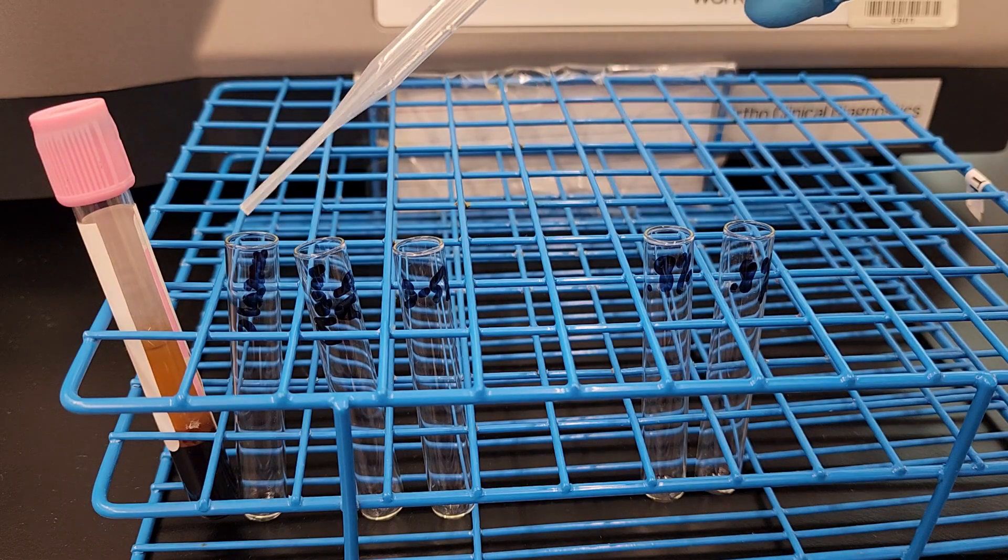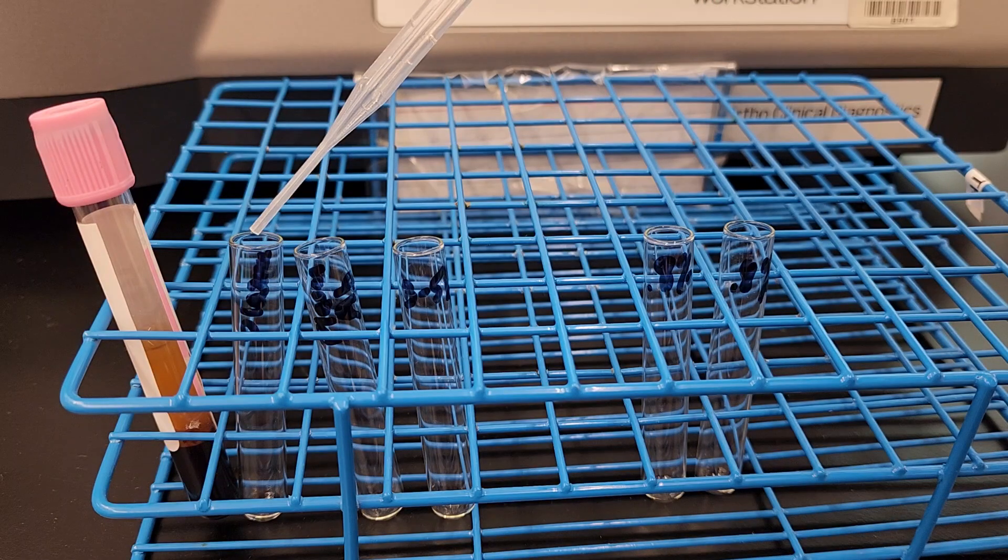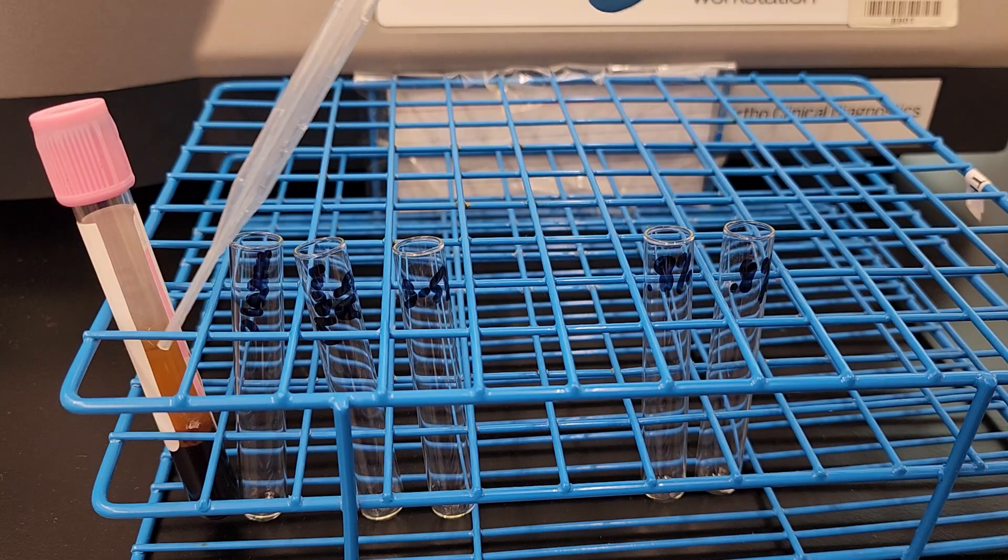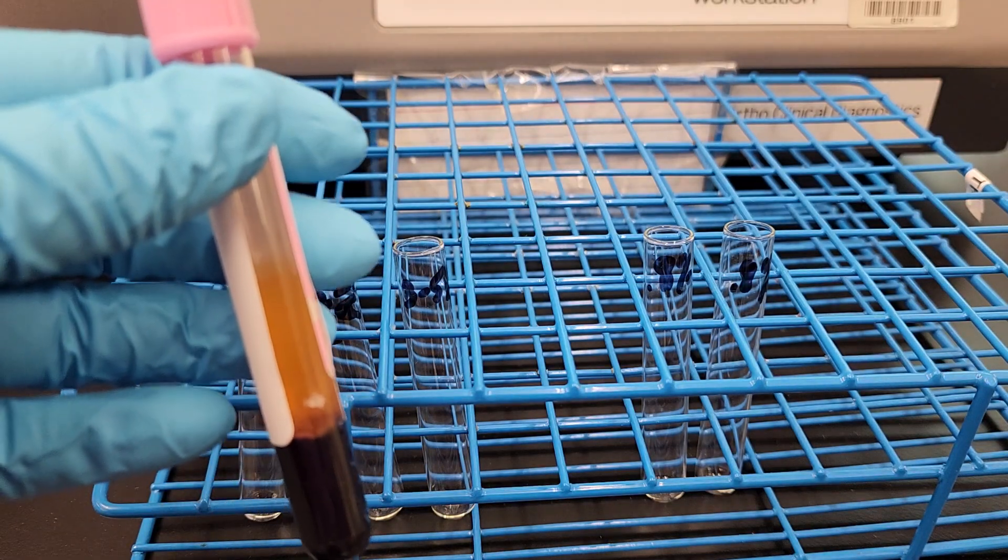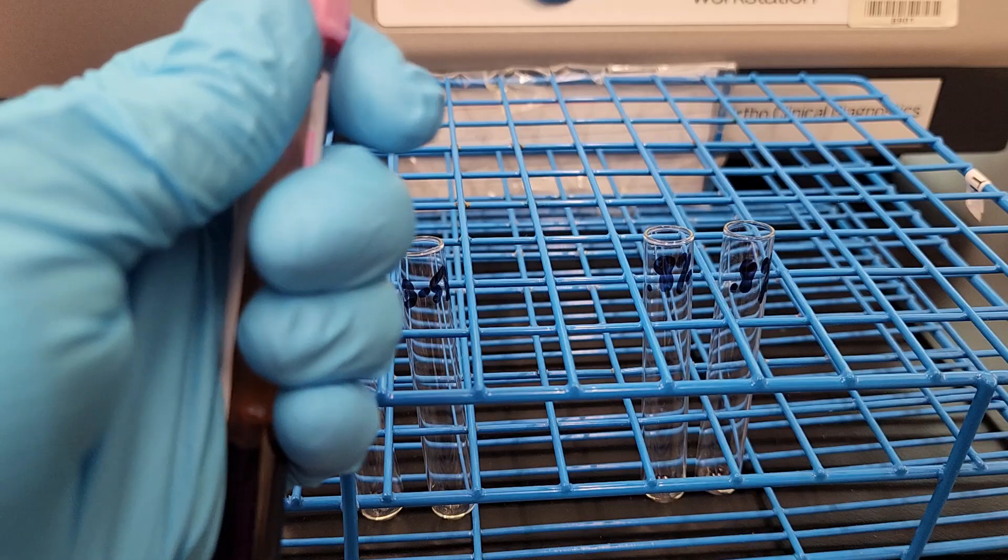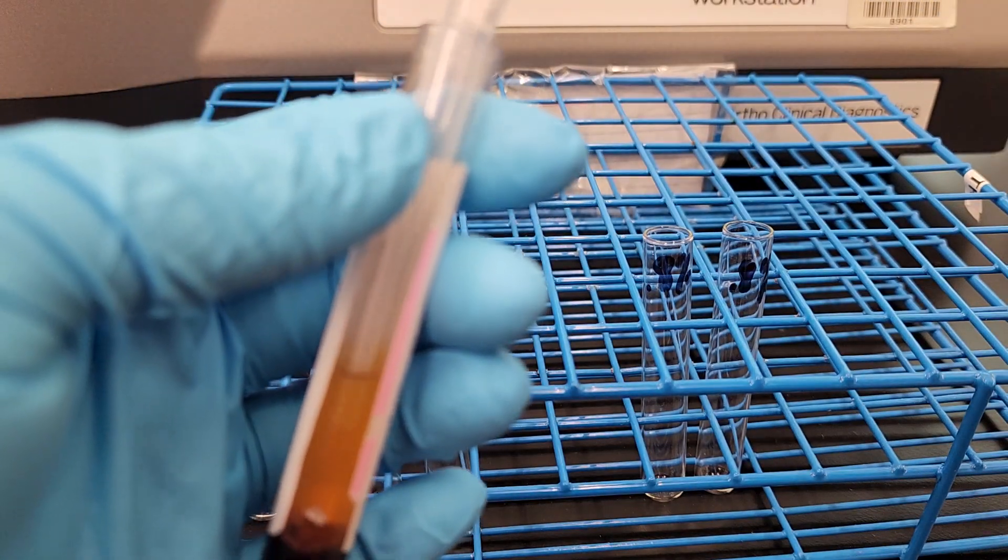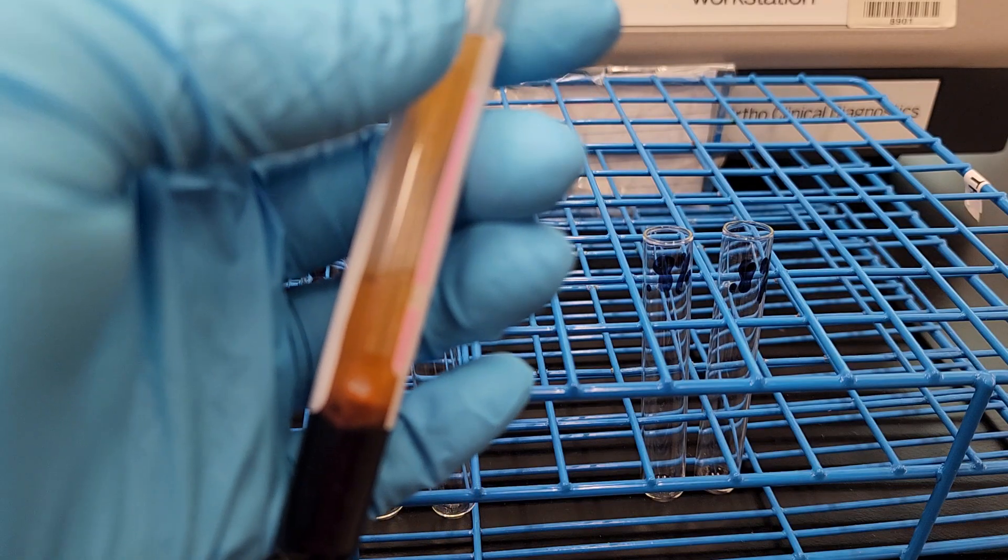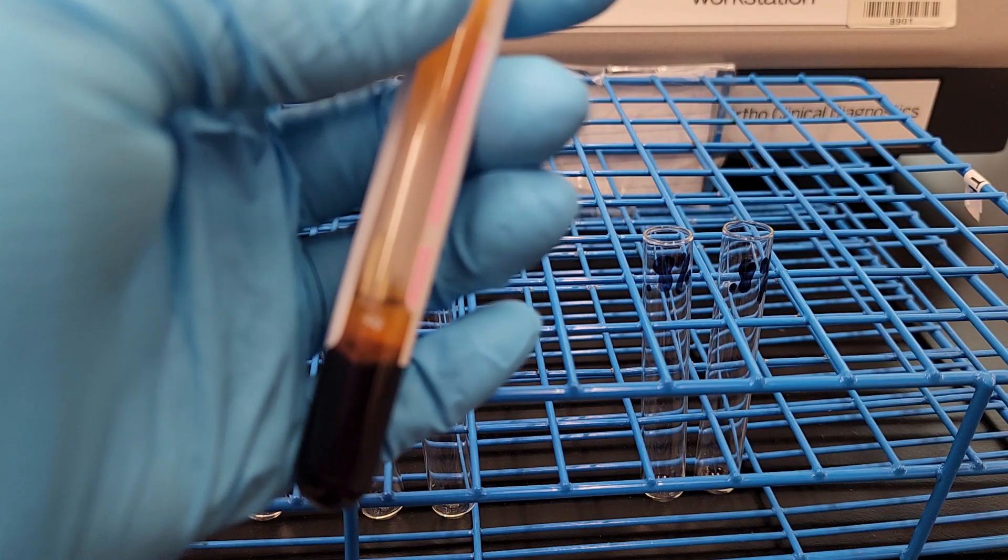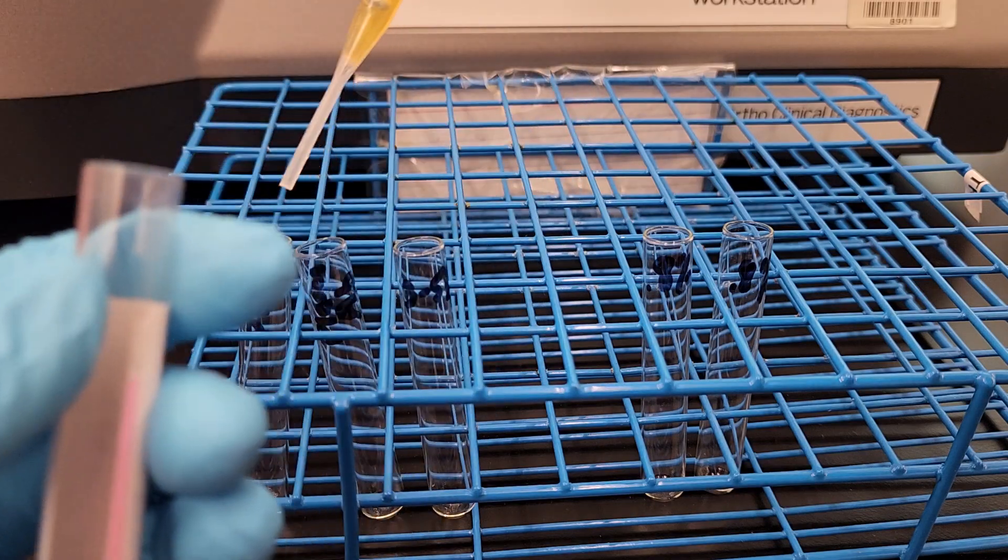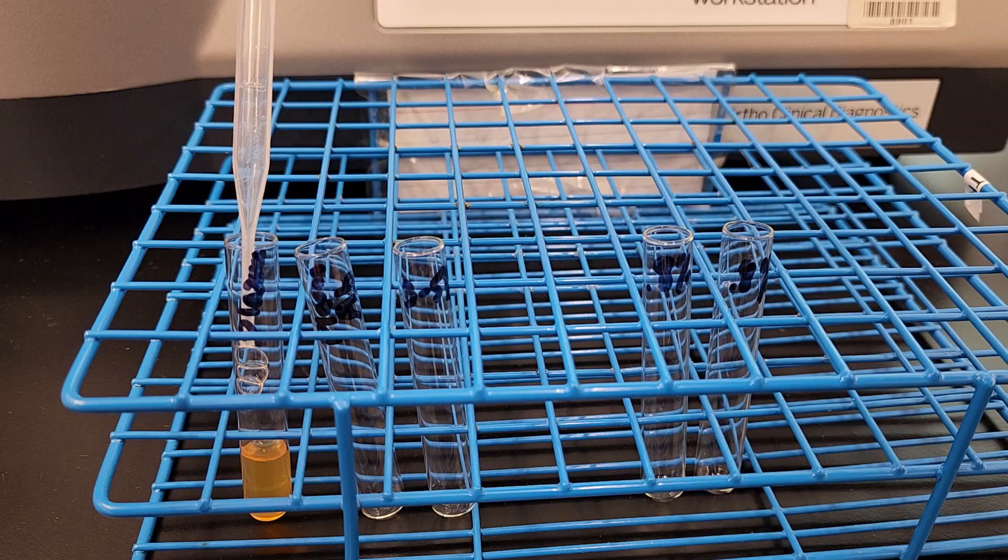What you're going to notice is right here I have a tube that says plasma. I usually have my students pull out the plasma off of the top of the patient specimen because we have limited number of specimens. And if you mess up pulling out the plasma and the red cells get re-suspended in there, you can kind of just chuck that part. And you've saved the rest of the liquid gold, right?